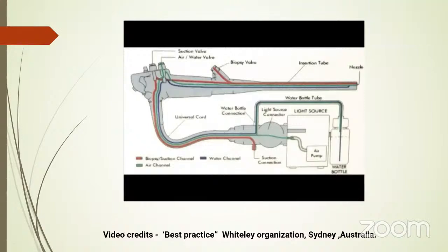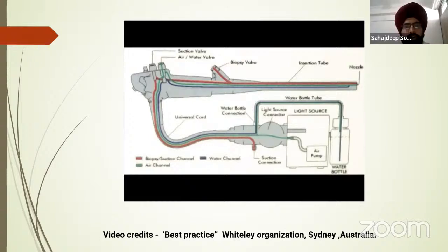But the injury to the endoscope can be caused not only on account of disinfection, it can also be caused on account of its use. While doing a surgery, sometimes if you bend the endoscope too much, there can be a rupture of the sleeve or the insulated coating around the endoscope, and that can lead to a positive leak test. So it is not only disinfection injury, but also the actual use of the endoscope. That was the point I was trying to make. Right, sir. Thank you.